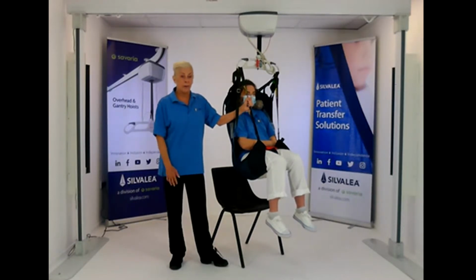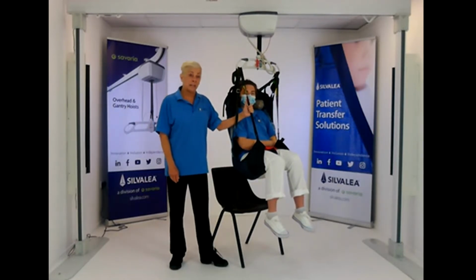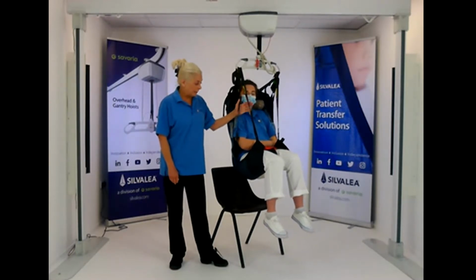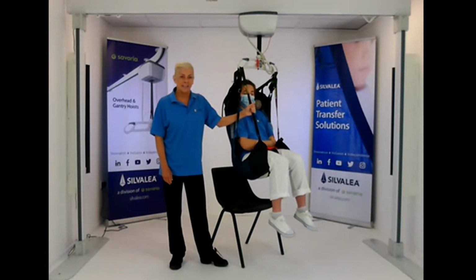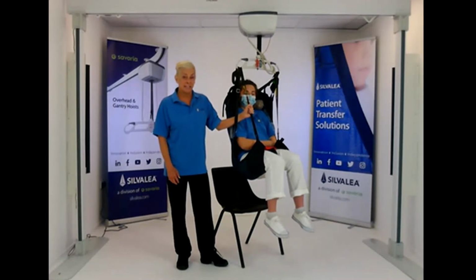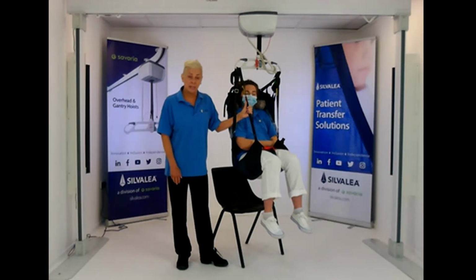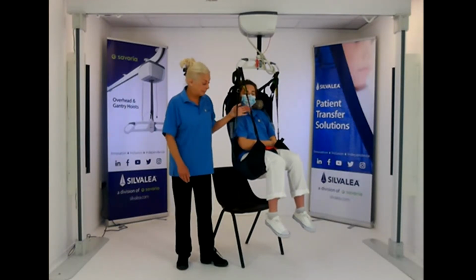So working out whether it's easier. If someone doesn't like to be handled, you need to reduce the handling and application of the sling. So it might be helpful in that scenario. But certainly, there's more to it. You can't say we've got an in situ sling, we can leave it in on everybody. You really do need to risk assess each individual situation. But we can help you. Certainly, we've got different styles and we have different fabrics, so we can certainly help with your choices.